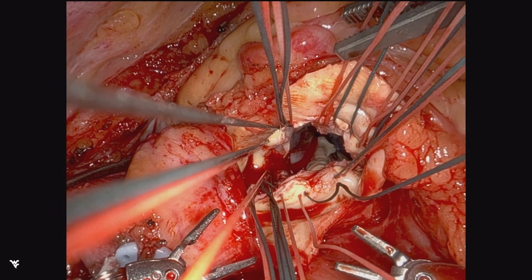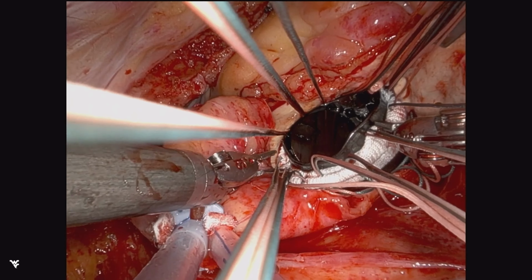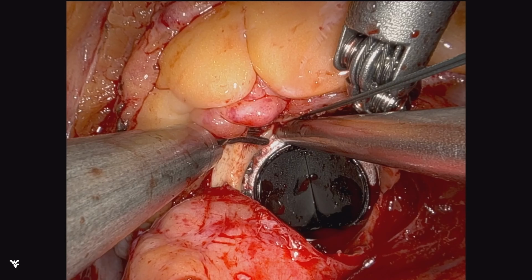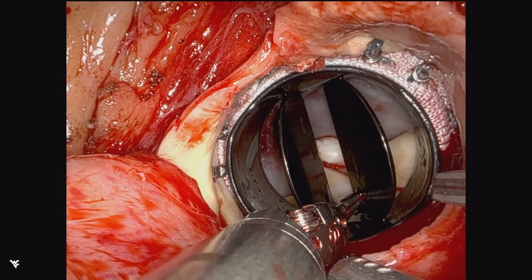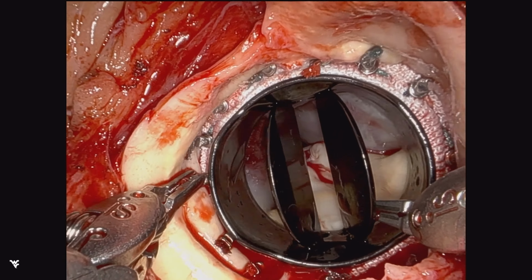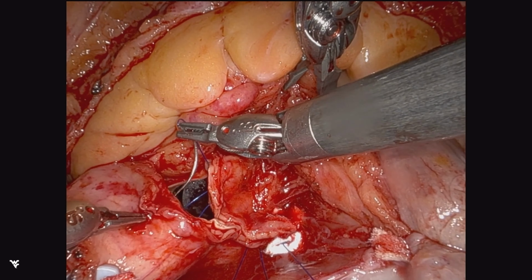And so here's our result. This is a younger patient also requiring a mechanical valve. As I'm sure our audience knows, the bicuspid pathology is often found in younger patients, but not exclusively younger patients at presentation.